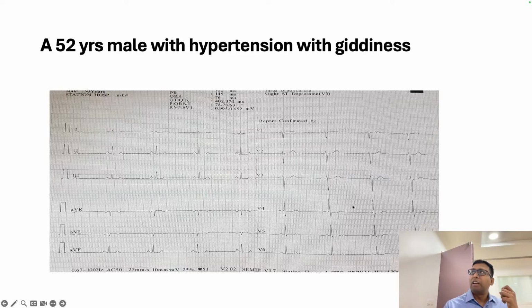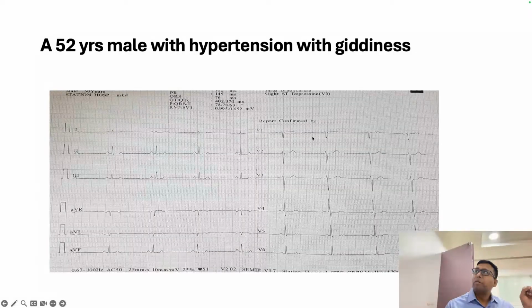Always, whenever bradycardia happens, try to see the T waves. Never ever comment sinus bradycardia without seeing the T wave and its morphology. See, you are seeing the P wave is here, blocked. Whenever you are having doubt, you always bank on two leads, as GJ was saying, lead 2 and V1. Here you will get a proper P wave. You can see the morphology of these is almost the same. This is the same. Now again you have to come here, and some blip is coming here. So it is a blocked APC.